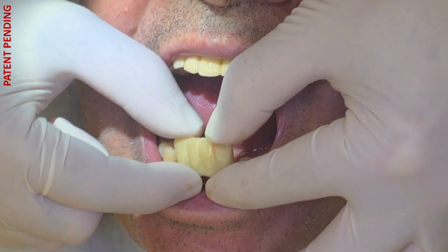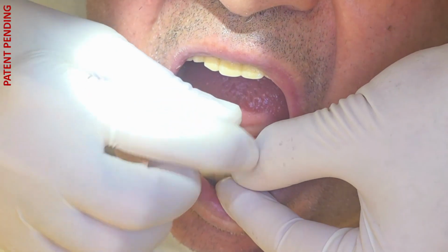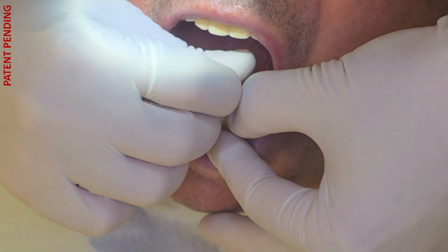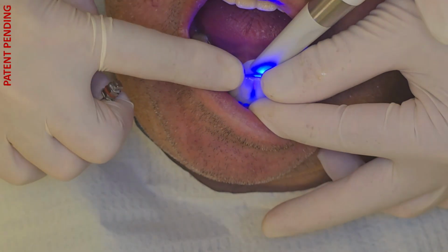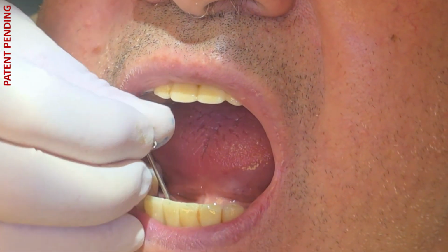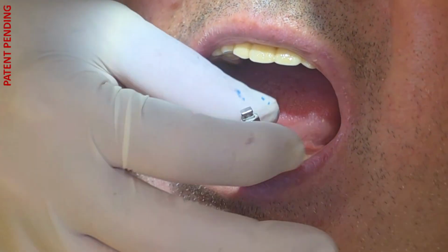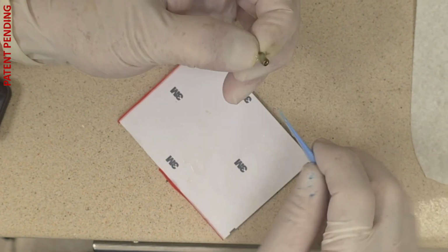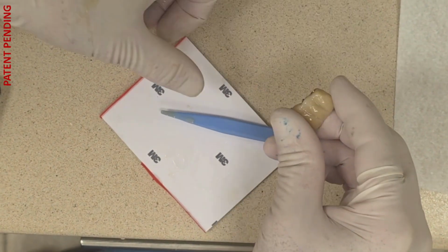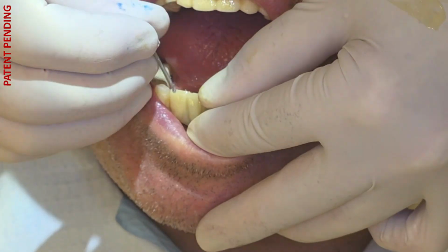We place the bridge, nothing interferes with the construction. We tighten the screws. Before the adhesive sets, the bridge remains slightly mobile, so it must be held manually. Polymerization is performed. After that, we check the occlusion. We unscrew the bridge to bond the master sleeve. The same rules apply. We return the structure for polymerization.